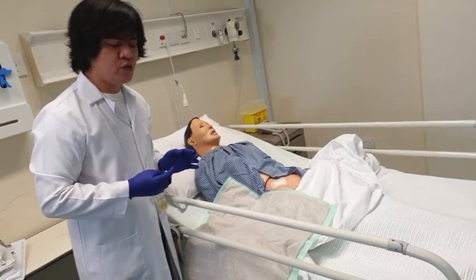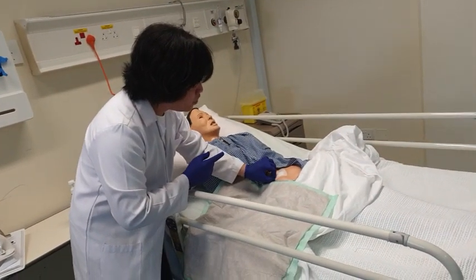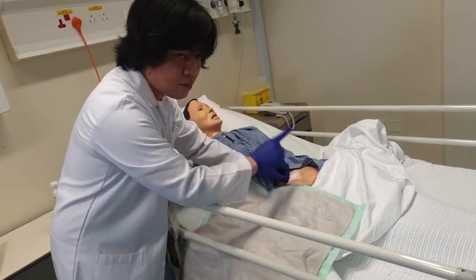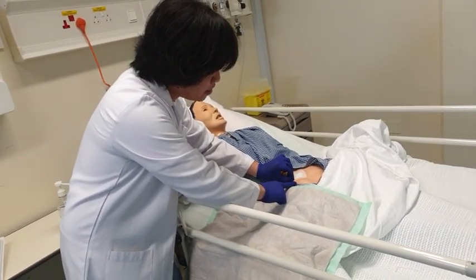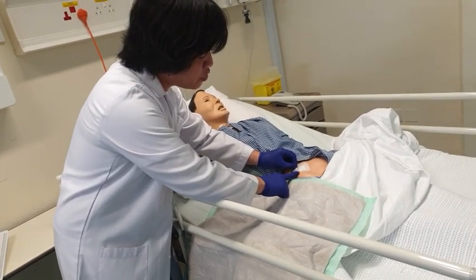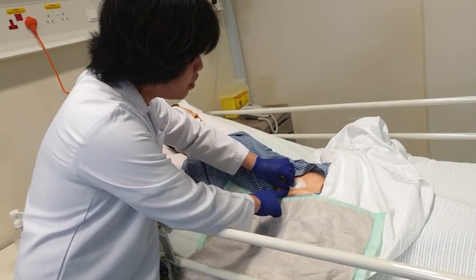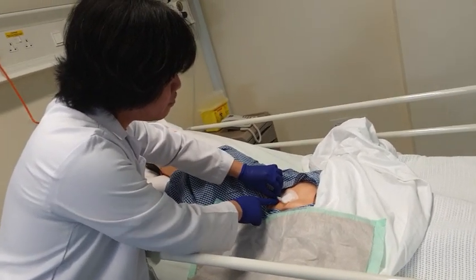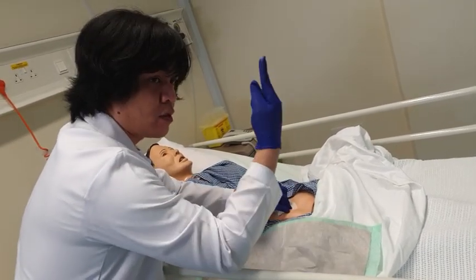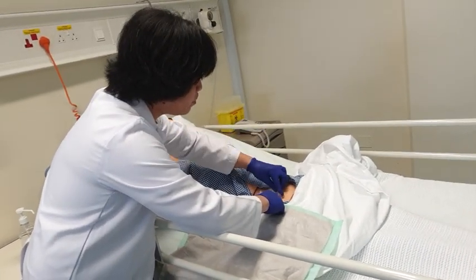How do we remove the old dressing? With the use of your finger, start from the corner of the dressing and support the skin by pushing it down like this, see? Remove the dressing towards the center of the wound. Be very careful because it is very painful. Again, towards the center of the wound. All sides: one finger will support the skin while the other finger is removing the dressing.